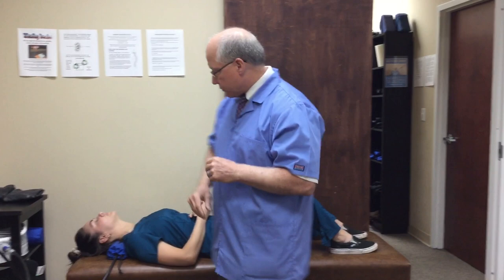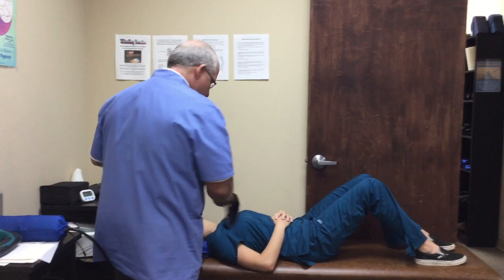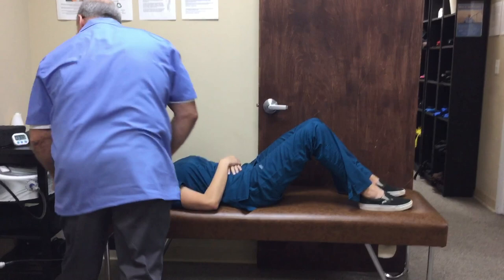Cameron right now is laying over the roll, so it's bringing her head back over the shoulders and putting the curve in the neck. That's going to relax the spinal cord, and we want to get this to become permanent. So we use something called the cervical vibratory traction. We put a five pound weight on which helps bring her head back over the shoulders into the curve of the neck, and then we turn the vibration on.